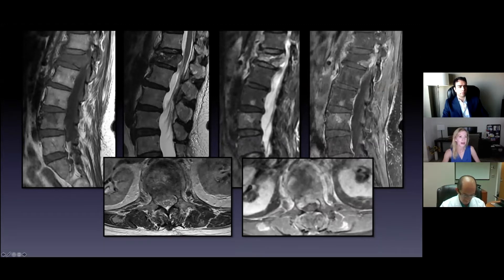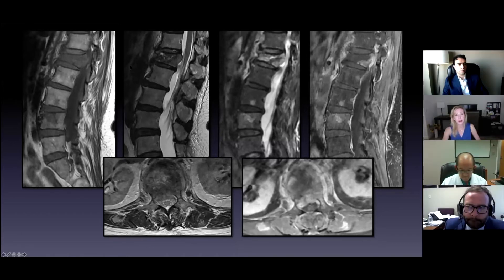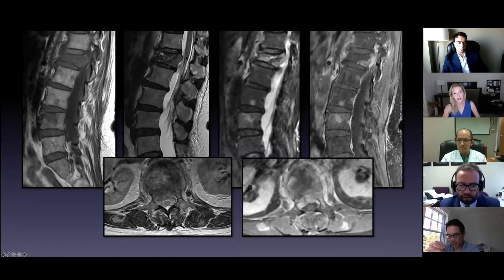That's sagittal T1. Normal bone marrow is white because it's got fat in it. This one is not white — it's stark because it's completely infiltrated with tumor. It's also got a pathologic fracture, with the compressed posterior cortex bowing out into the canal, compressing the thecal sac and the cauda equina. Down here there's another small one in L3 and one in L4. Sagittal T2 shows the cerebrospinal fluid and shows better than the T1 how much thecal sac narrowing there is — retropulsion of the posterior cortex into the canal, compressing the conus.